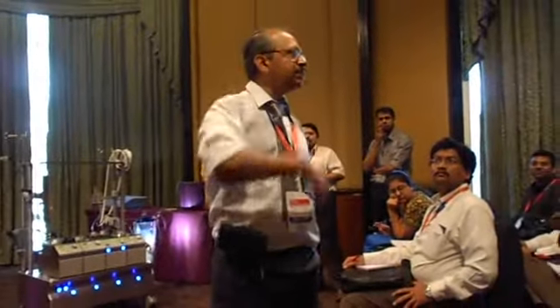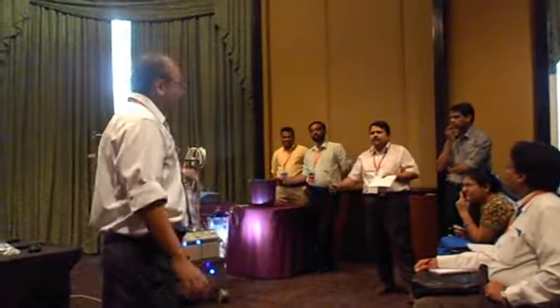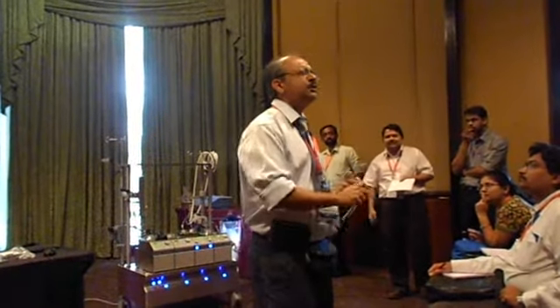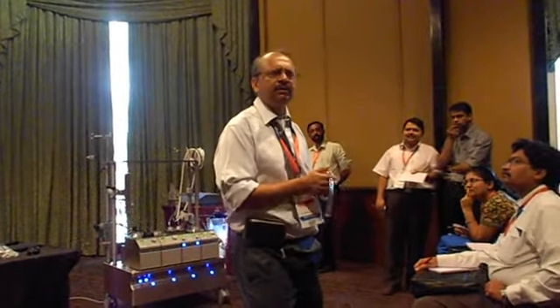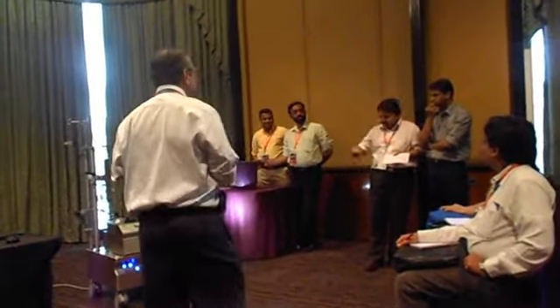To make matters worse, I will tell you the current also went down. Compressor not working. The only thing working is the battery. So your hands are moving faster and faster, but the perfusionist is telling you, sir. So I'll ask the perfusionist to run the pump with his hand.